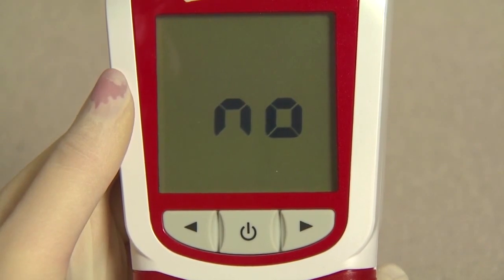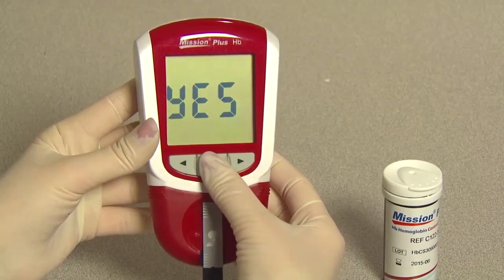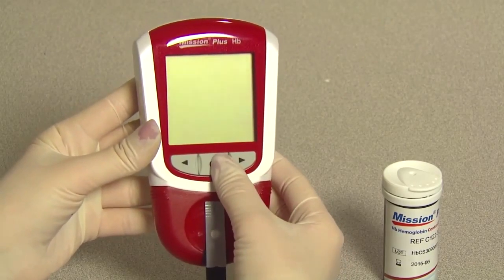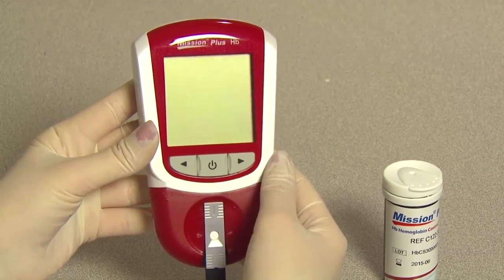Check the control device or control strip for contamination or to see if it is damaged. If there are any visible signs of damage or contamination, discard the control device or control strip and retest using a new one. Press the power button to return to the setup screen or navigate to the ELT screen and press the power button to return to the testing screen.